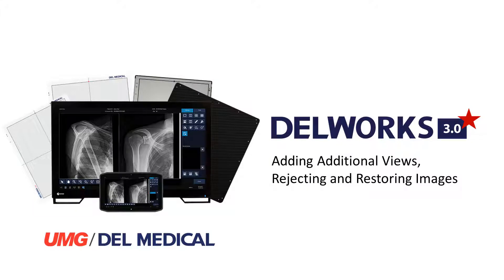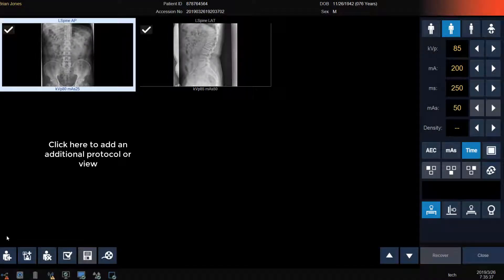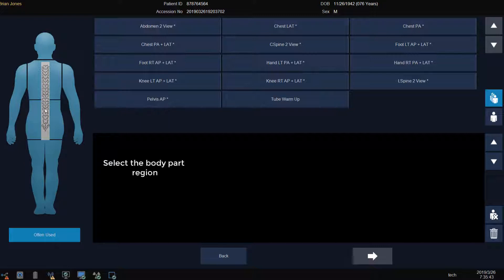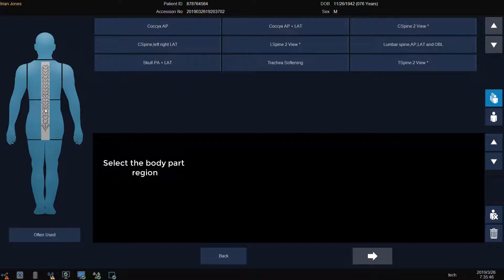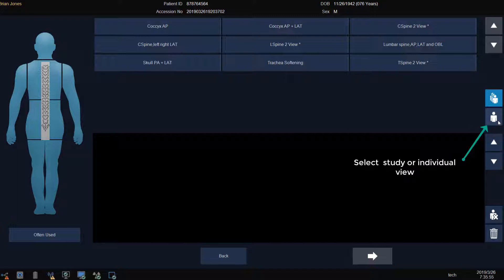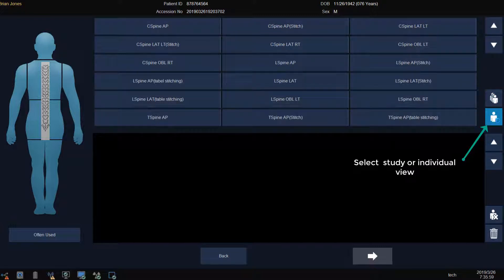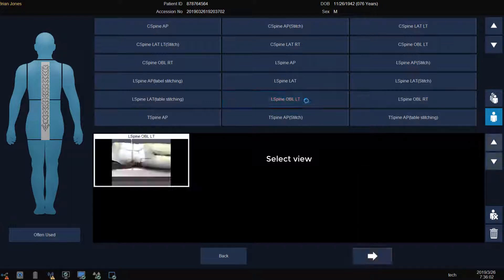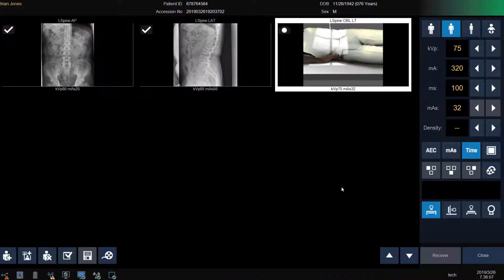In the next section of this video, we will review adding additional views and rejecting or restoring rejected images. Click on the icon with the man and the plus to add an additional view. Select your region, then select the protocol that you want to add, or click on the single man icon to see a list of individual views in that body region and then select the view. Now click on the arrow. We've now added a lumbar spine oblique view and are ready to expose.